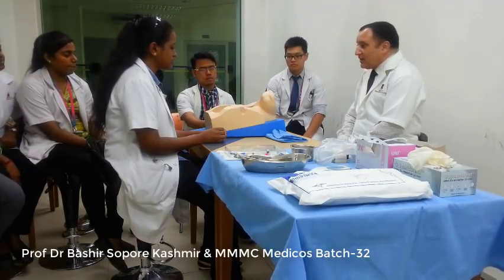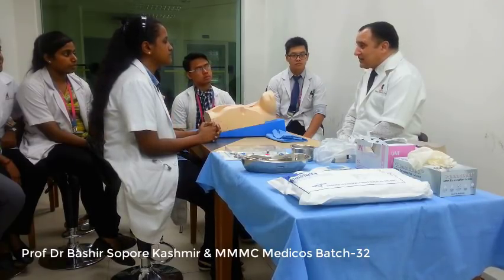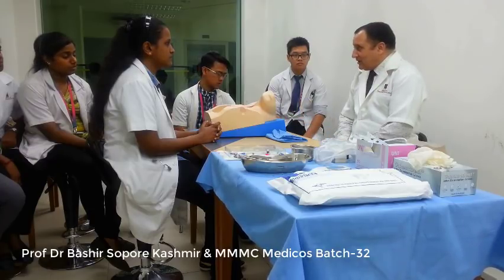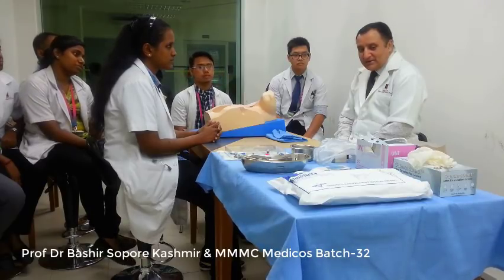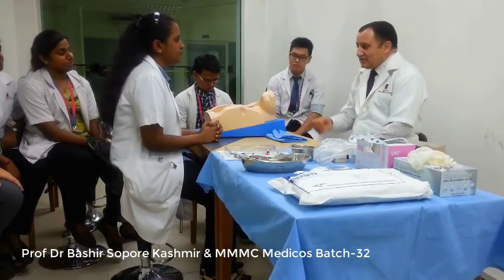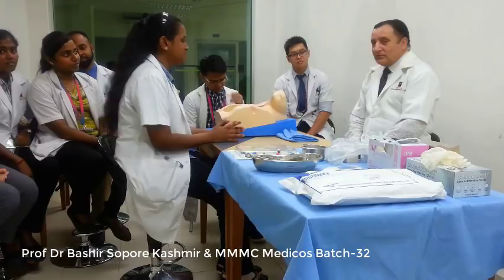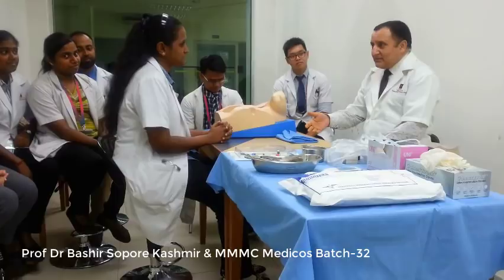And if the patient agrees and gives you the consent, then you will maintain the privacy of the patient. You will take the patient to a side room, a room which has got good privacy. What will you do next? The next step is that you will put the patient in Trendelenburg position. The patient's head should be tilted downwards around 15 to 30 degrees.